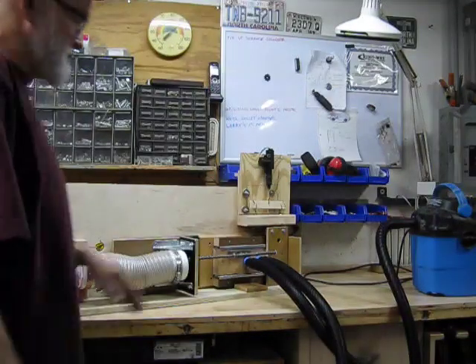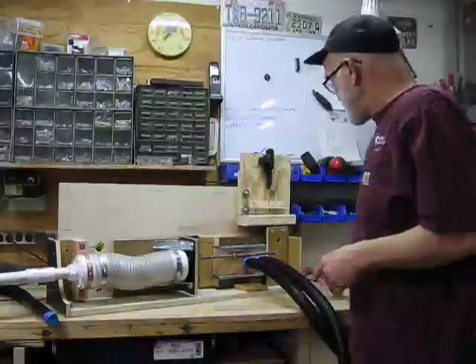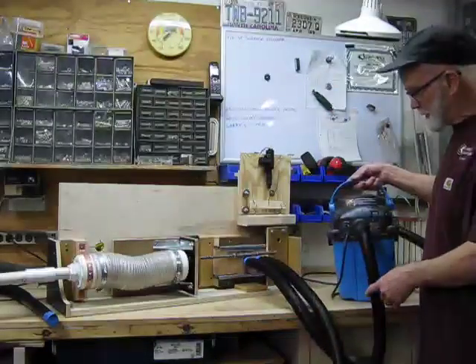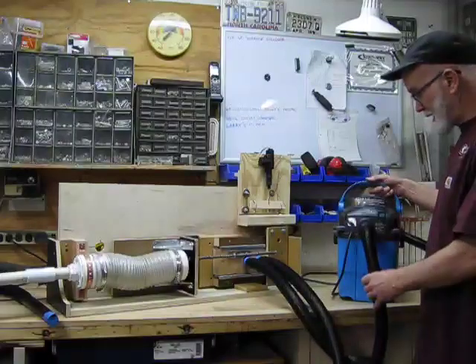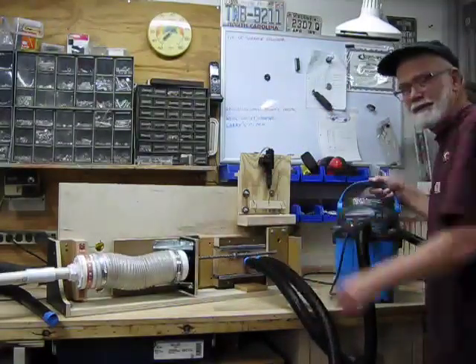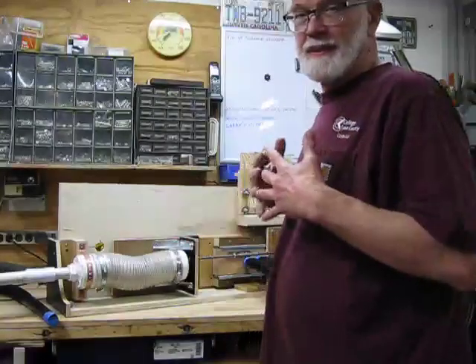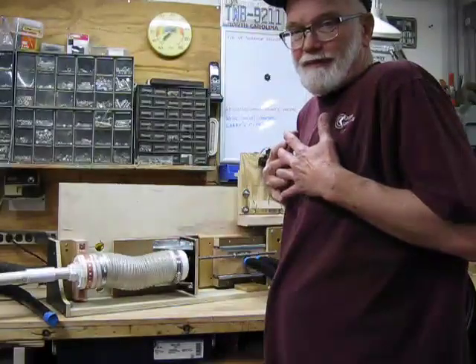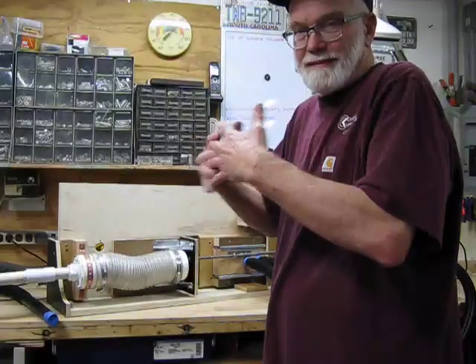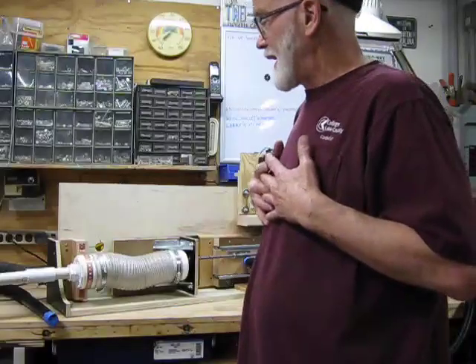All right. Now this is some crazy redneck stuff here. There's a vacuum cleaner. The blower side is hooked up here, on the back side here. The idea is to inflate, to pull and push air out of a box.